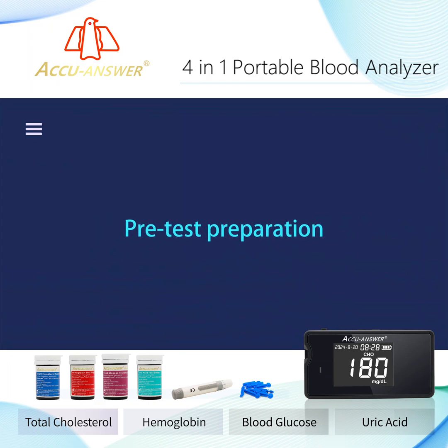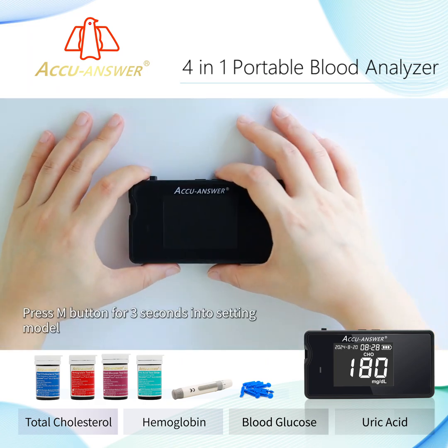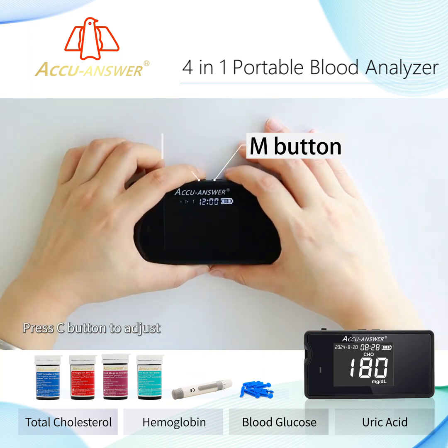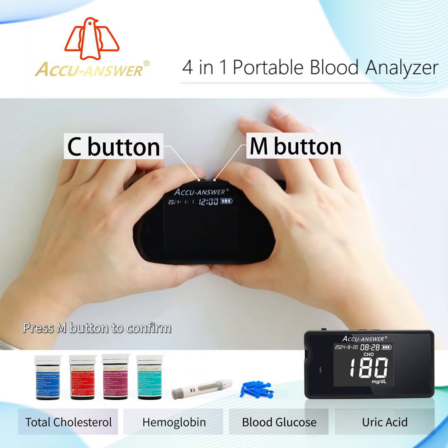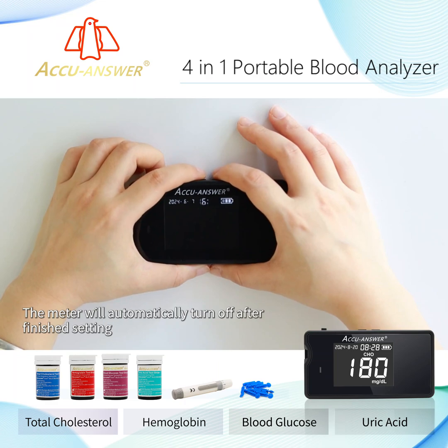Pre-Test Preparation — Time Setting: Press the M button for 3 seconds to enter Setting Mode. Press the C button to adjust, then press the M button to confirm. Use the same steps to set the month, date, and time. The meter will automatically turn off after finishing.